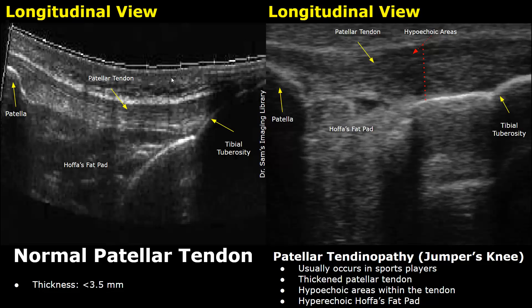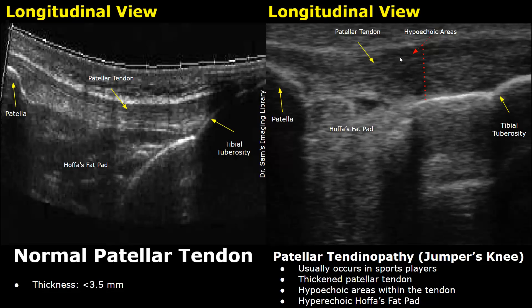This image is in a longitudinal plane. Here we have an image of patellar tendinopathy. The normal AP thickness of the patellar tendon is approximately less than 3.5 millimeters, but this can vary amongst different individuals. In tendinopathy, the thickness of the tendon will increase — you can see an increased thickness of the tendon and it will be filled with hypoechoic areas.